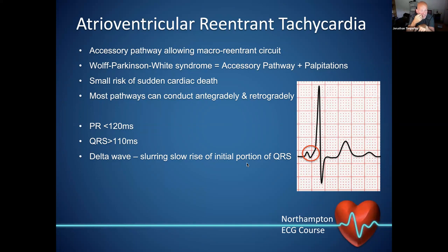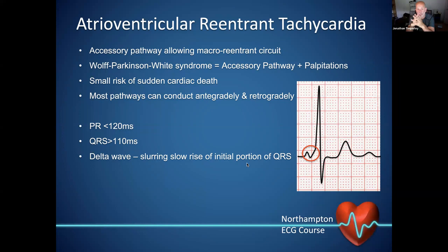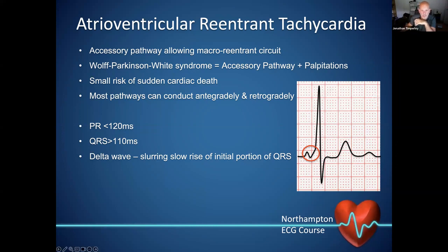Most accessory pathways can conduct both antegradely and retrogradely. It's quite uncommon to get an antegrade-only or retrograde-only pathway. On the resting ECG, we look for a PR interval less than 120 milliseconds going to the nearest deflection after the P wave, and a QRS duration generally greater than 110 milliseconds with an overt delta wave. In this example we have a short PR interval of around 80 milliseconds, a delta wave, and then — after normal AV node conduction takes over — a QRS that looks relatively normal.